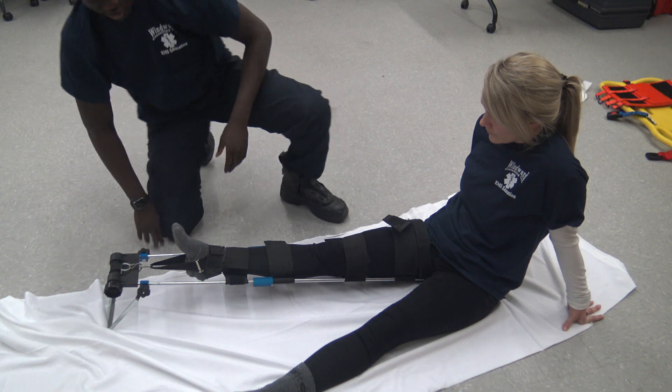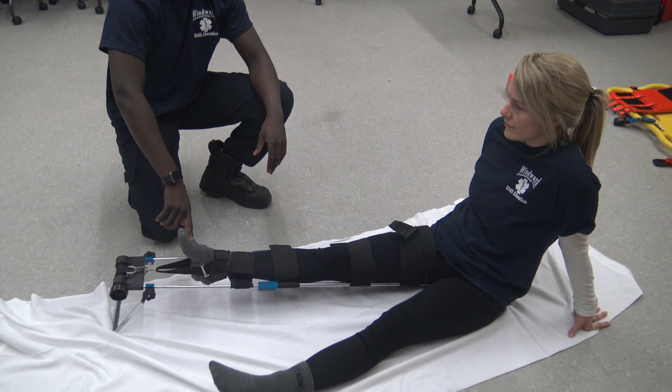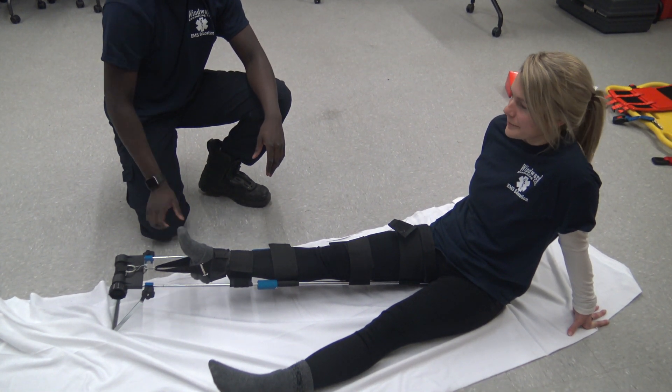Now I'm going to go through and reassess for CSMs. Feel for a pedal pulse. Can you feel me touching your toes? Yes. And then what toe am I touching? My big toe. Perfect.